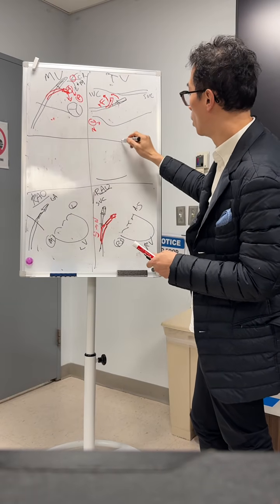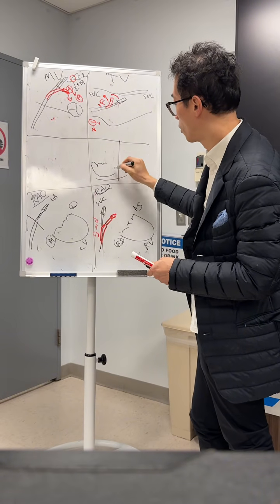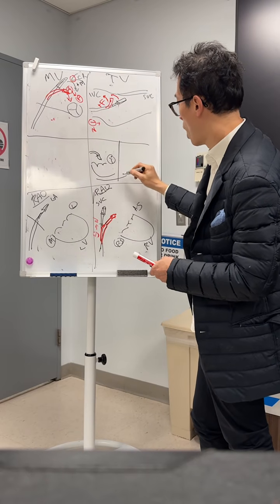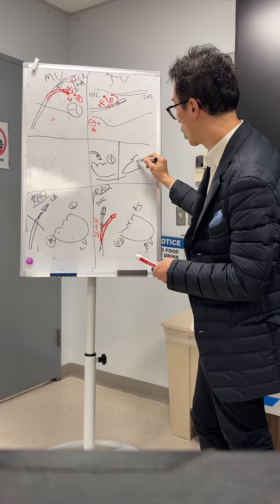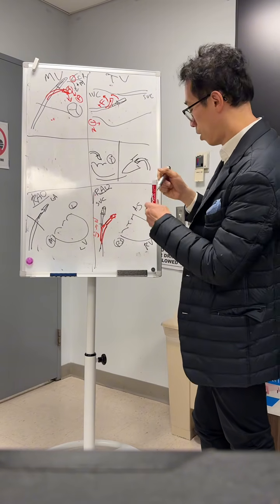Right? So now you have to do an inflow. Let me just show you briefly like this. So that you see the device coming down this way, while on the reverse four-chamber view, you see this is IVC, remember, it starts going this way. Okay?